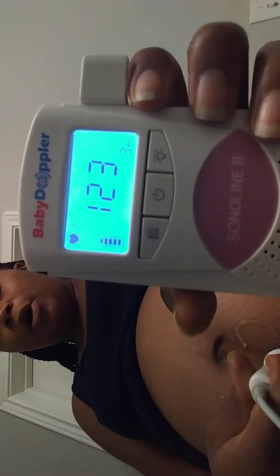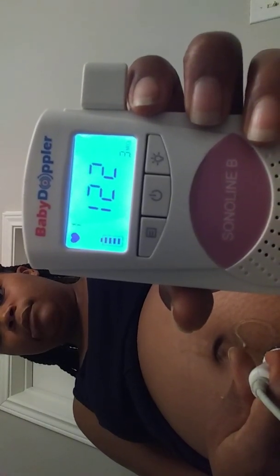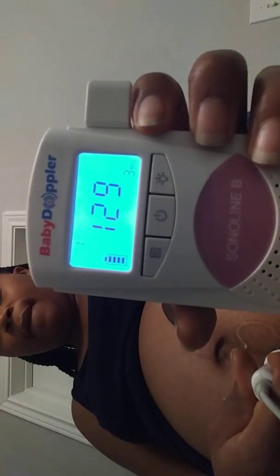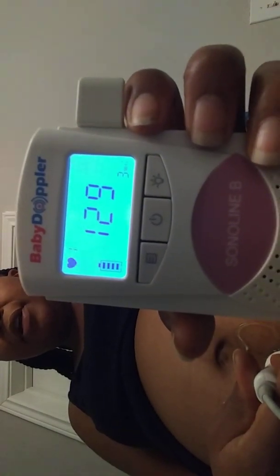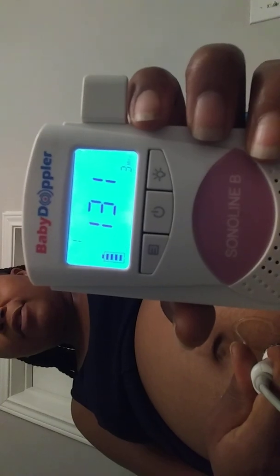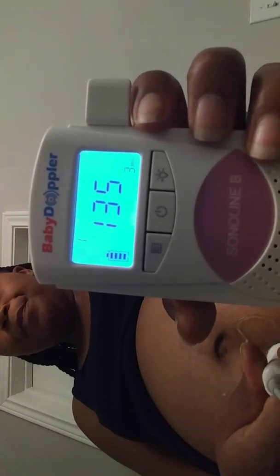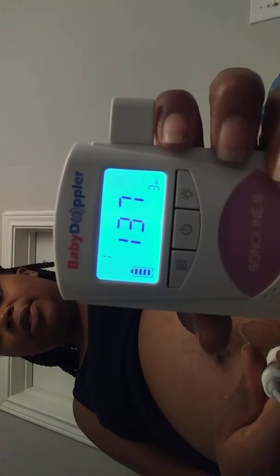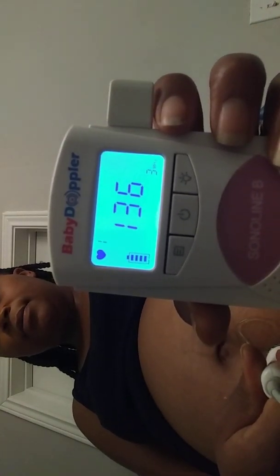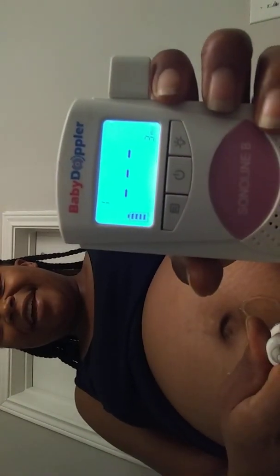There's a nice strong heartbeat. Now that my baby's bigger it's harder for him to move around to get away, so it makes it a lot easier to put it on him. As you can see it's still going — he's just trying to get away now.